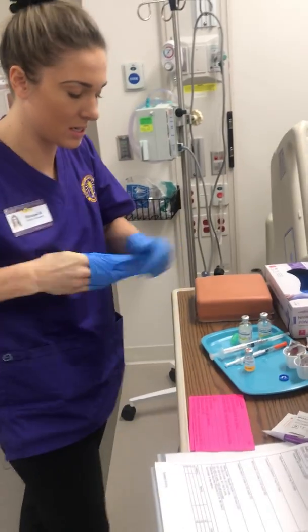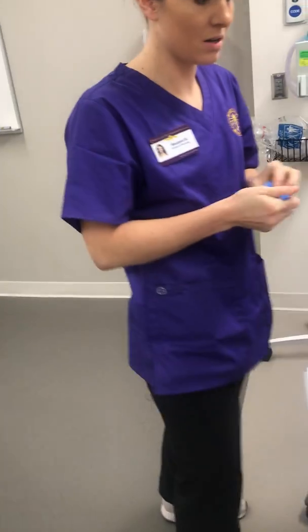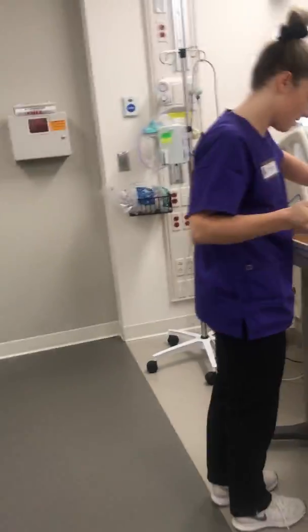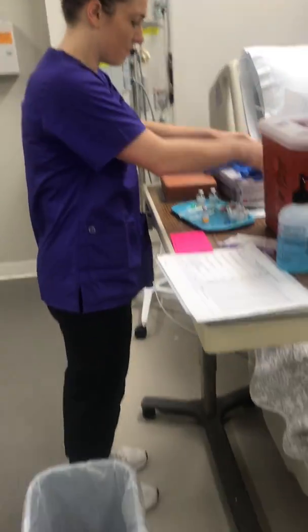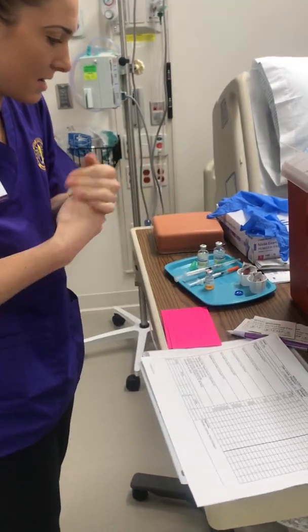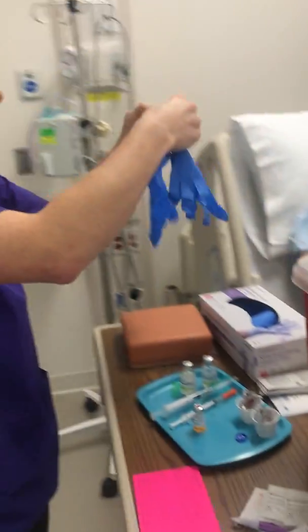Okay, and then I'm just going to take those gloves off. And then I would throw them in the garbage here. Then I'm going to wash my hands again, and then let's do my first one, which is the Fluzone. I'm going to put my gloves on here.